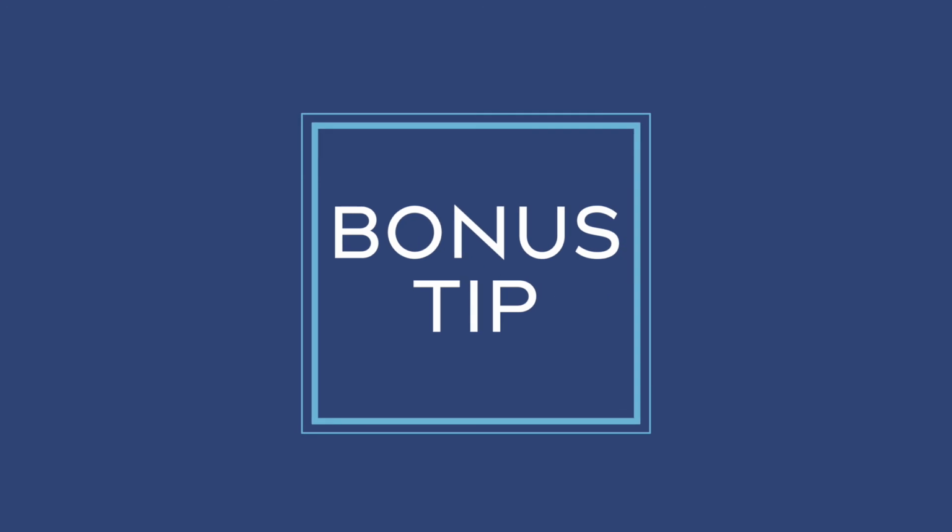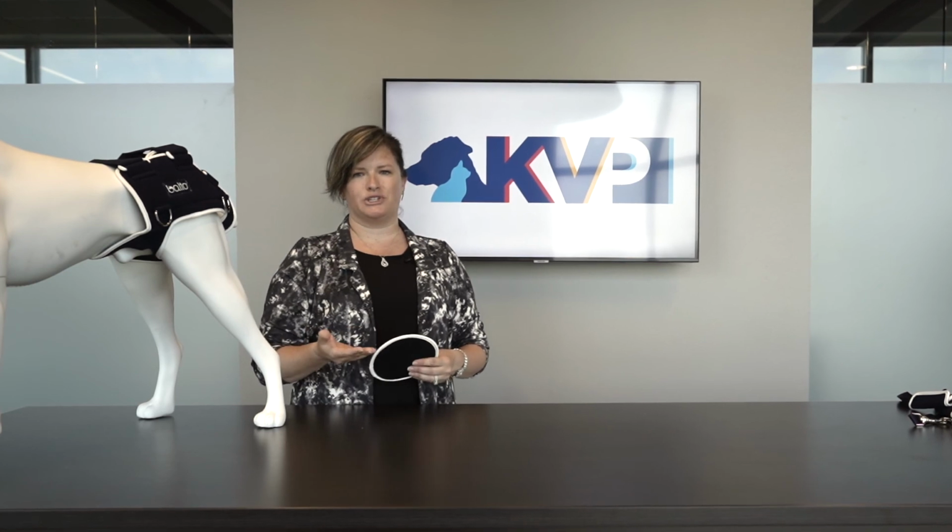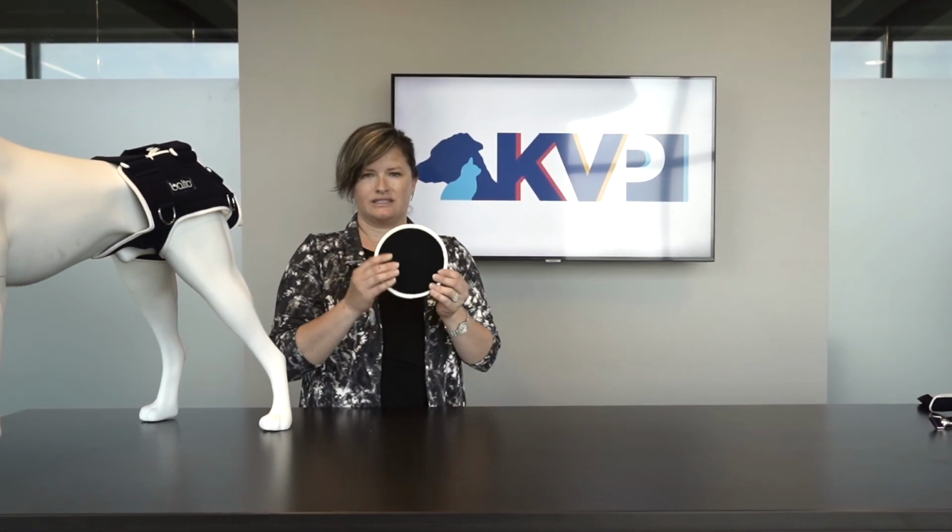So we have a bonus tip for you for the Balto Life brace. One of the things you can do to assist your patient with comfort is take these discs, which are going to sit on the greater trochanter, right on the point of the hip, and you can actually freeze these. So you freeze these overnight, and then when you apply it the next day for the first 20 minutes, you actually have a cold compress on your patient.